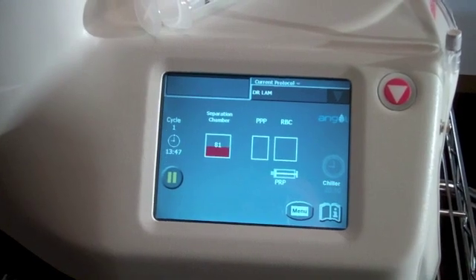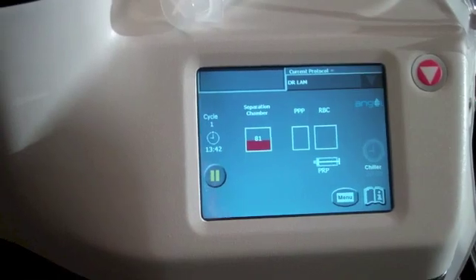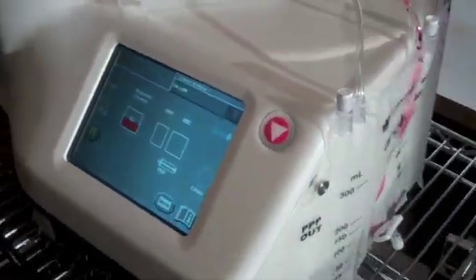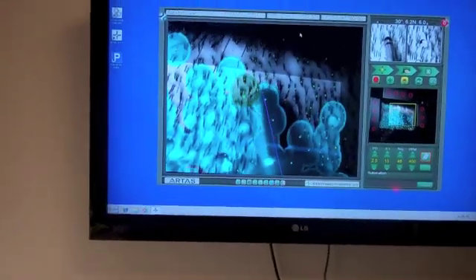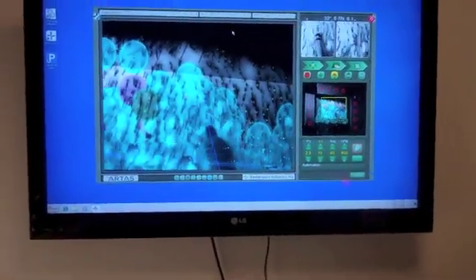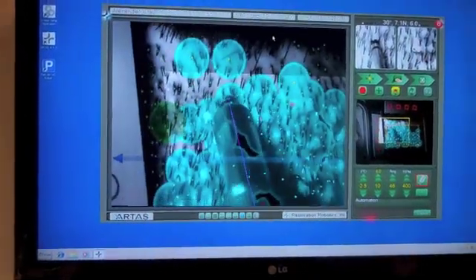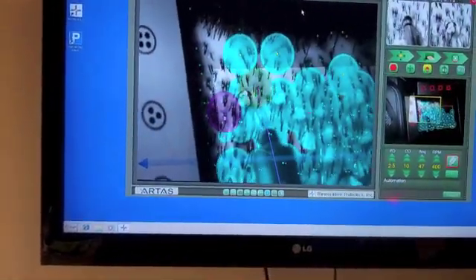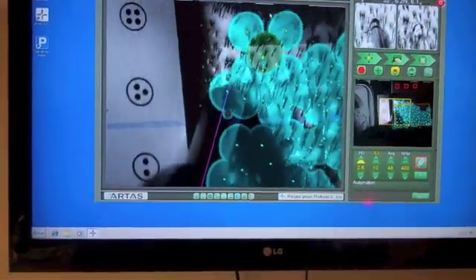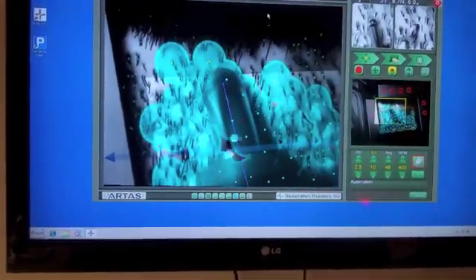In my opinion, robot technology is the cornerstone to what we're doing, but it's not enough — without regenerative medicine, you're not going to get the graft growth potential you would get with this type of procedure. You can see how accurate the robotic technology is in harvesting the grafts with absolute precision. The green signifies the next one, and the blue ones are where we've already harvested, leaving a generous number behind so the donor area looks as clean as we started.